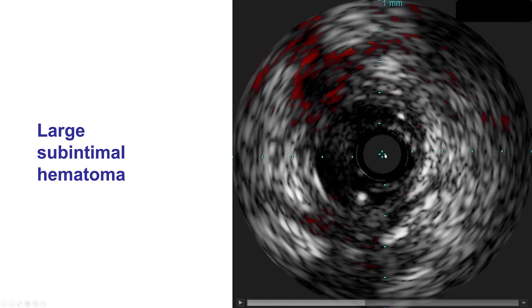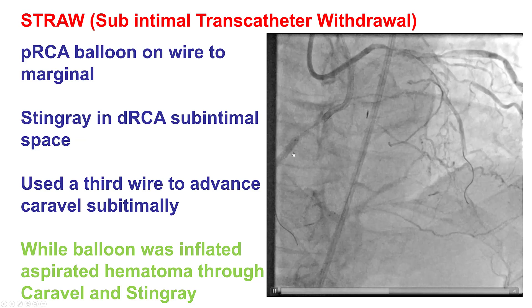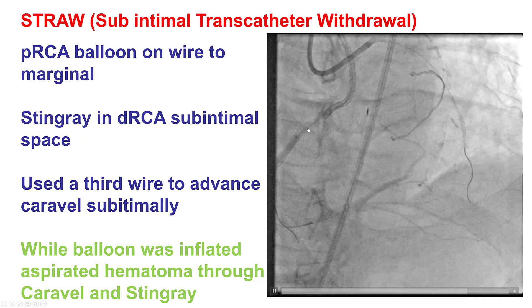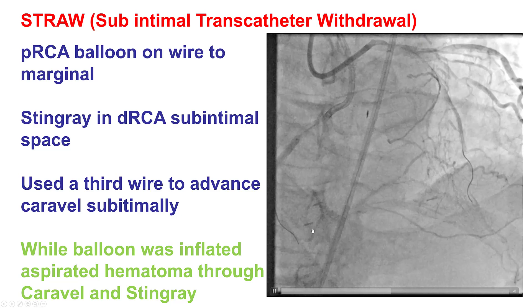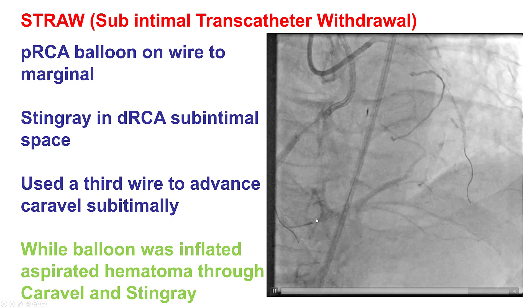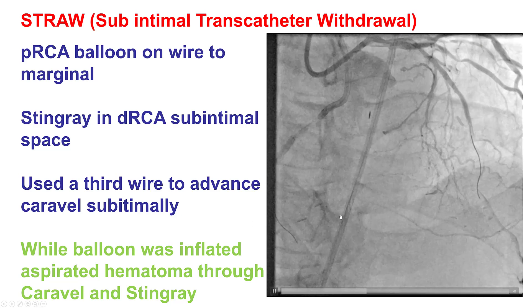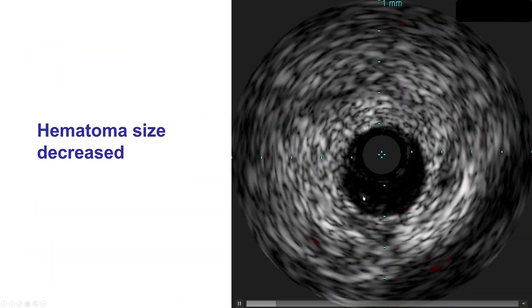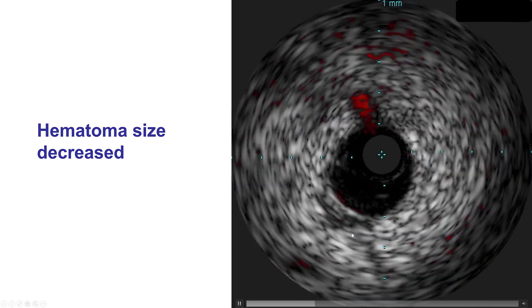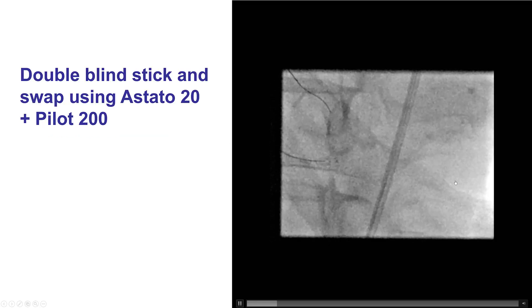This is the true lumen with the IVUS after crossing, and this is the subintimal space with the original guide wire in it. To be successful, we decided to do the full straw technique: a balloon blocking blood entry into the subintimal space, a Caraval microcatheter advanced through which we did aspiration of blood to decompress the hematoma, and then we also delivered a stingray balloon. That allowed re-expansion of the distal vessel and decrease of hematoma size, which helped with successful re-entry using the double-blind stick and swap technique.